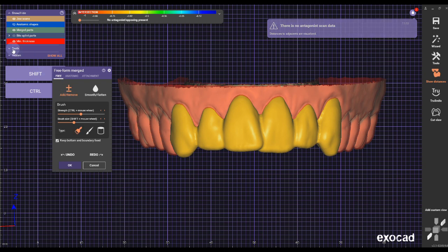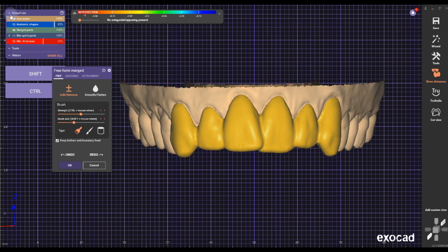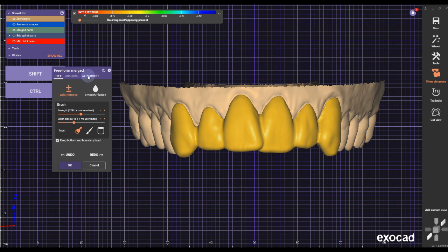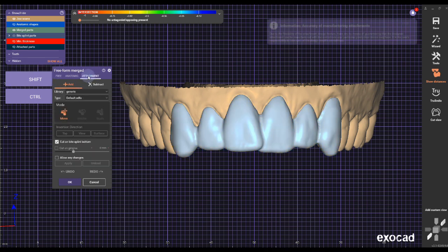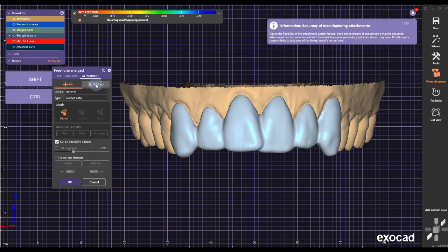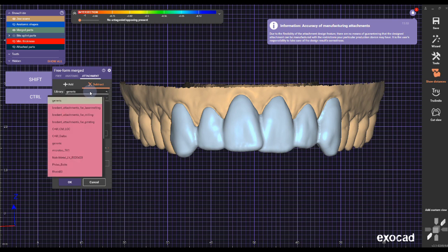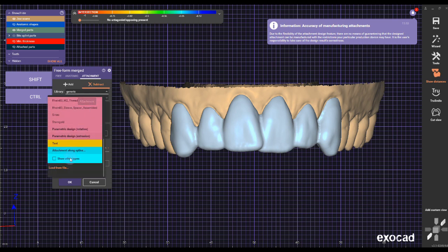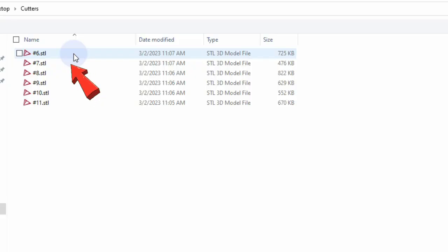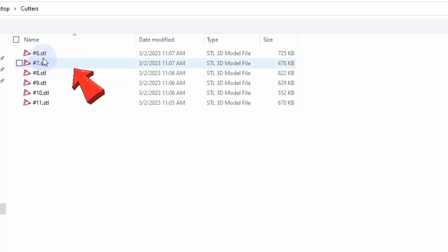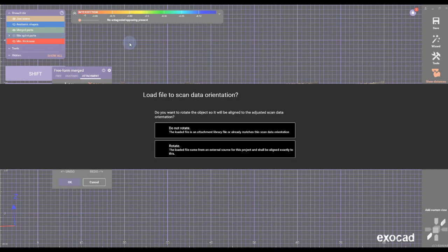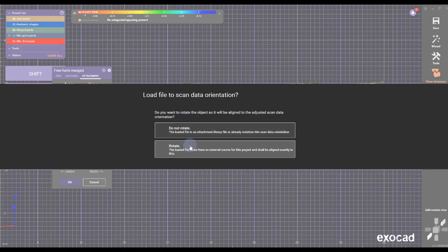Go to Attachments — you can turn off minimum thickness if you don't want to see all the red. Go to Attachments and set it to Subtract. It's important — you don't want to add, you want to subtract. Go to Library, scroll all the way down to Load File, and load the files you created from the cutting method.